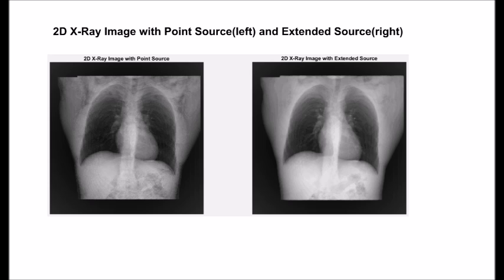With the extended point source, it is observed that we lost resolution, which was expected, because multiplying the image with a sinc function in the Fourier domain corresponds to filtering. If we keep the radius of the filter small, the peak of the sinc function will be high for a smaller area, so we allow only a small amount of information to pass through the filter. In the extended source case, we are allowing more pixels around to contribute, which causes blurring. So, when the extended source is used, the blurring effect can be clearly seen.